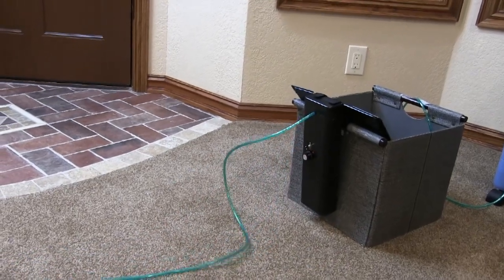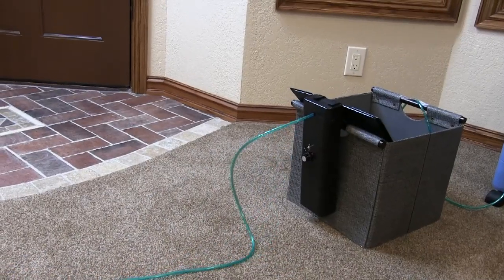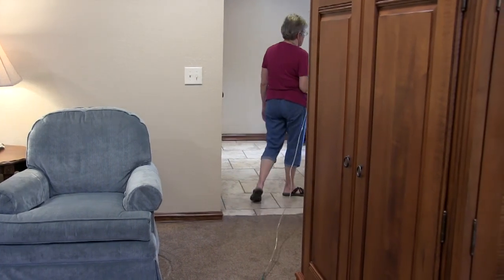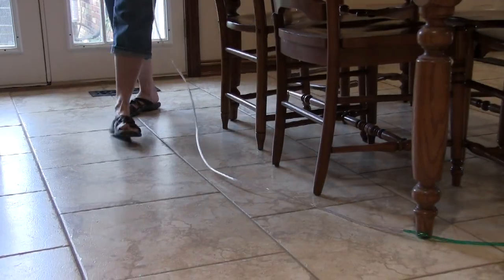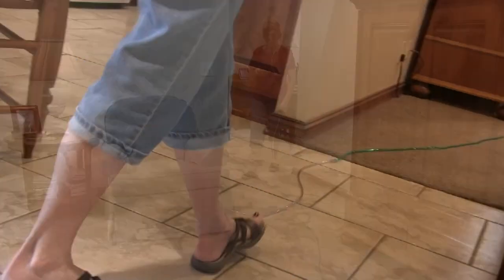Introducing the Oxytube Control Remote, a rechargeable, remote-controlled device that helps oxygen therapy patients manage their tubing. This revolutionary device offered by Oxytube Control Bags solves the problem of oxygen tube management.